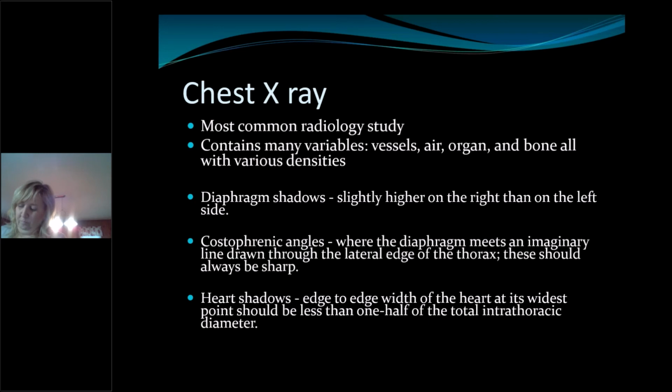These are what make chest films hard and make it frustrating. And these are why when you take the chest x-ray to 5 different radiologists, you get 6 different opinions. So the thing that you're looking for is commonality. Do we all agree that this is abnormal or normal? And if it's abnormal, what do we think is abnormal? And then trying to work it up if that correlates with the patient's clinical presentation.